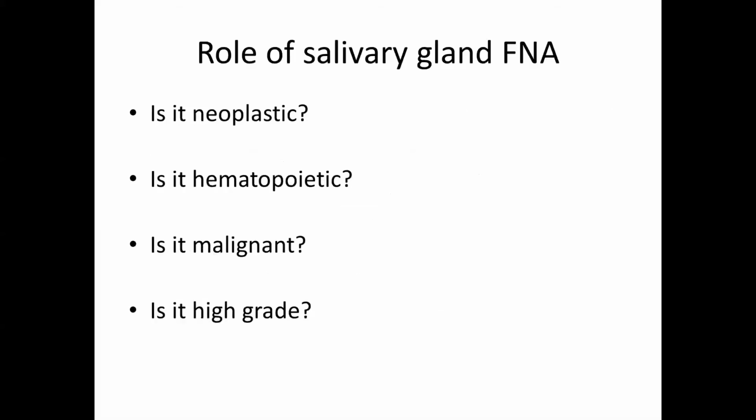Okay, so the role of salivary gland cytology in these lesions. Whenever you get a salivary gland aspirate from a clinician, just as with any other specimen type, you can think of it as encompassing a series of questions. And so that's the way to approach these in regards to reporting.